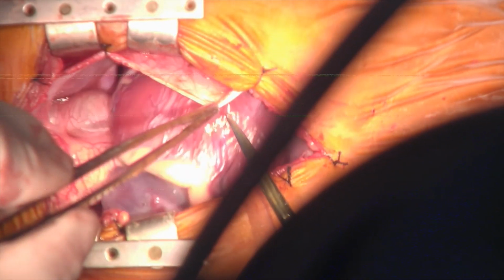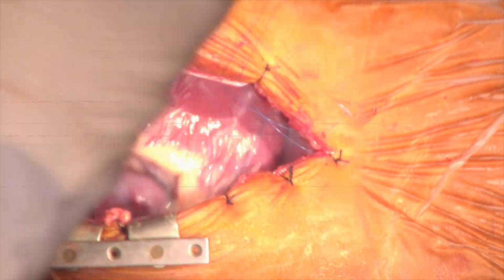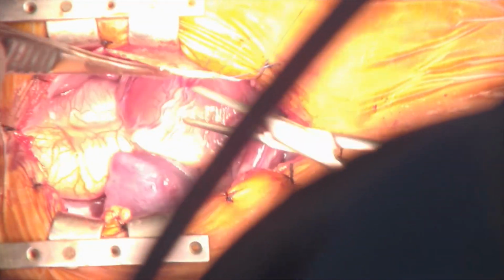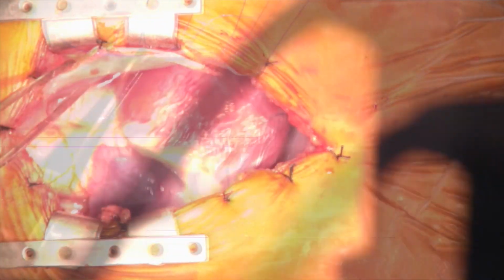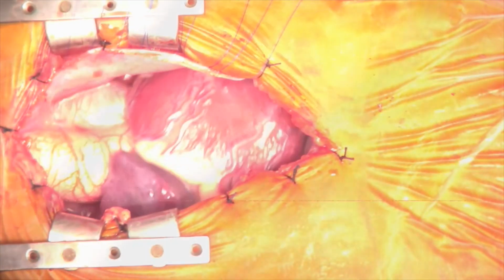The pericardial pledgets used in the repair of the ventricular septal defect are harvested now. Double-ended sutures have the needles pass through the pericardial edge, are pulled through, and secured. The process is repeated 4 more times.